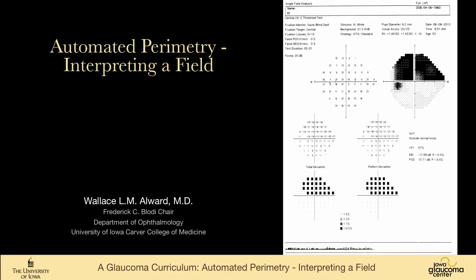I think that most of the concepts would transfer to neuro-ophthalmology fields and retina fields, although some things like the glaucoma hemifield test are specifically glaucoma related.